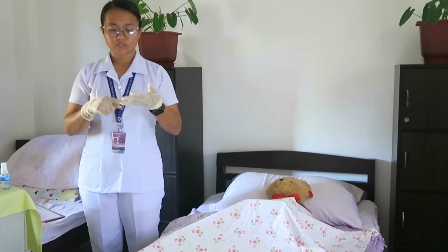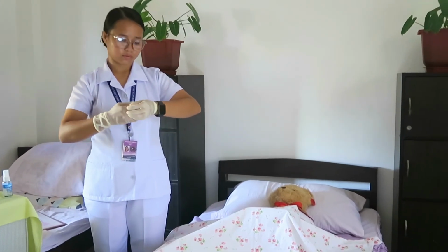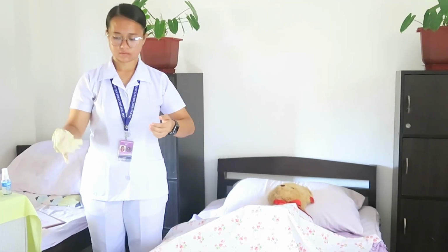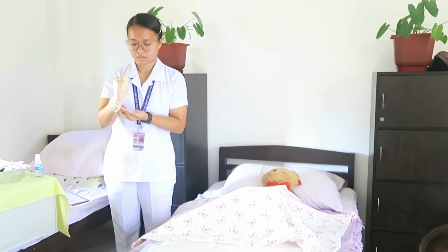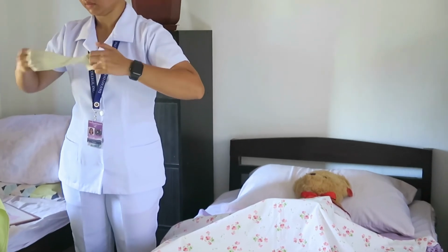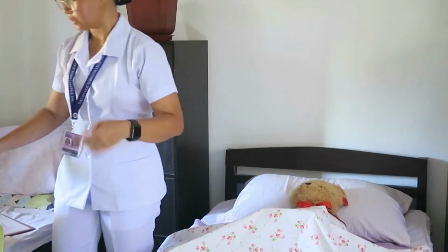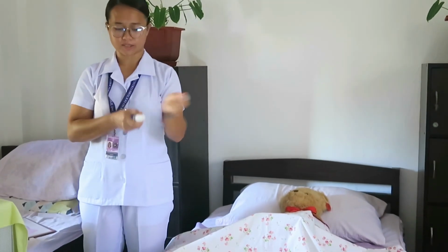Remove the gloves. This is to deter the spread of microorganisms. Then discard it. Then perform hand hygiene.